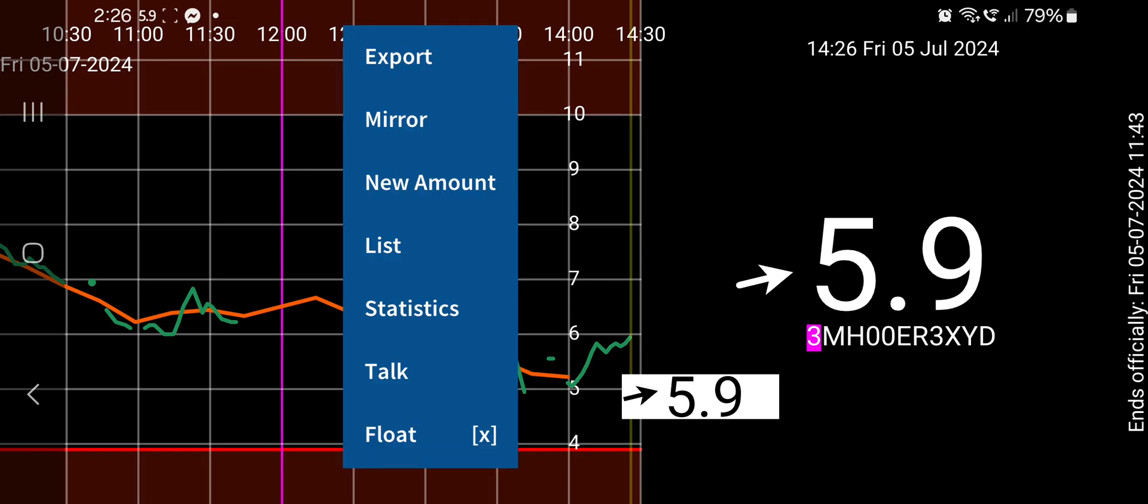It'll give me statistics. And there's the Talk function, Mirror, Export—so you can export a PDF.